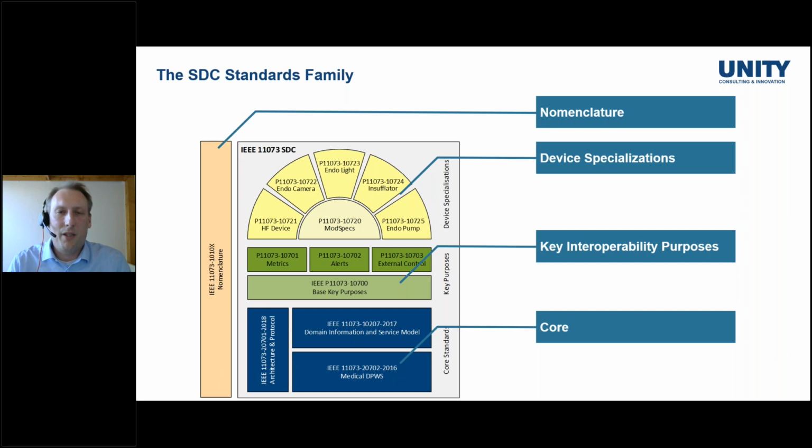And there, the main objective is to profile the technical core specifications for the three key interoperability purposes: metric reporting, alerting, and control. And the main objective here is to clear the regulatory pathway for allowing the integration of individually released conformant products at the hospital into one interoperable medical device system. And for that, they not only consider additional technical requirements, but also process-related requirements, e.g. regarding risk management or, for example, usability. From my perspective, that is one of the really interesting topics for the future, or for the next months, and actually related to the regulatory strategy of product development.